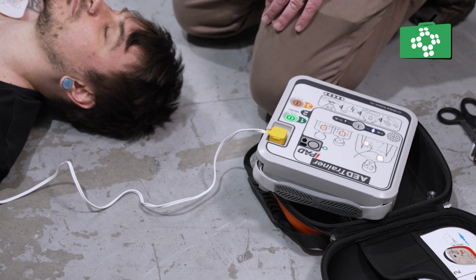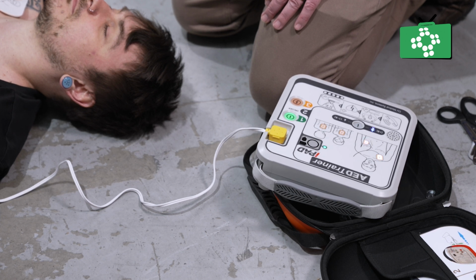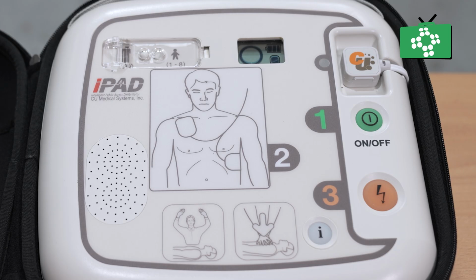Once the pads are in place, the AED unit will start analysing the heart rhythm automatically. You must follow the voice prompts when it says do not touch the patient to avoid anyone else getting a shock or the AED detecting another heartbeat. Ensure no one is touching the victim. Loudly state something like, "Everyone stand clear." The unit will tell you it's assessing the heart rhythm, do not touch the patient.